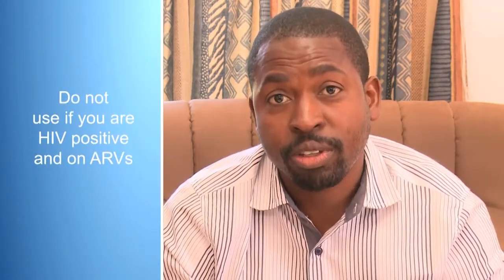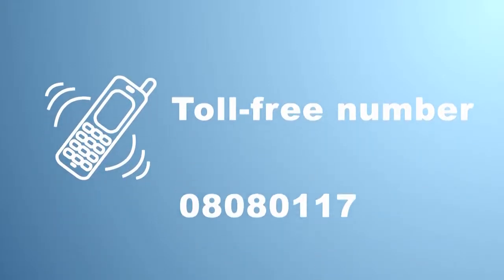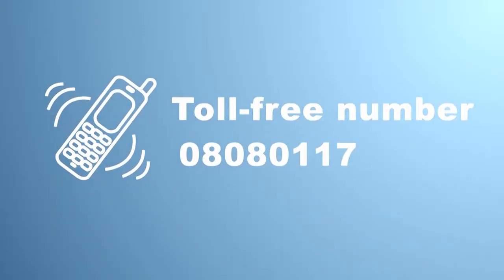If you are HIV positive and are on ARVs, this test can sometimes give a false negative result. Do not use this test if you are HIV positive and are on ARVs. You can ring the toll-free number 08080117 if you have questions about the test procedure or if you would like to discuss your result.